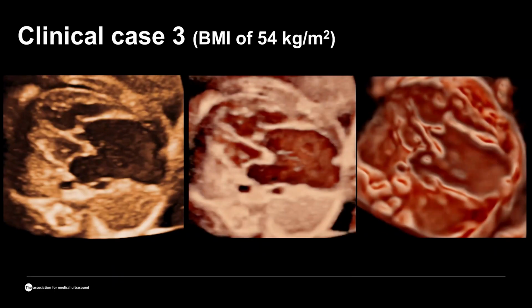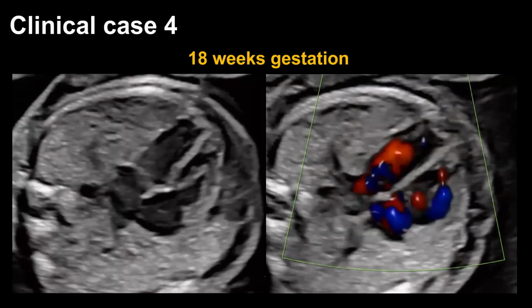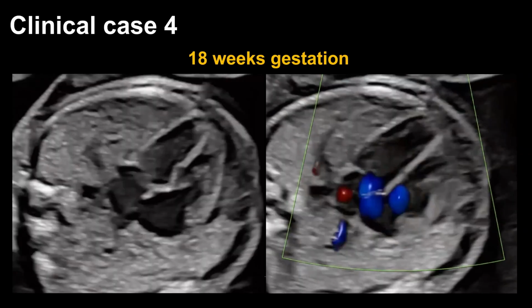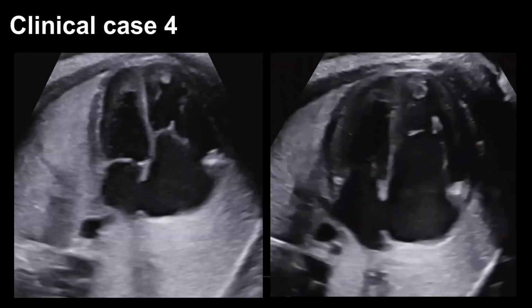And of course, we can reconstruct this heart that has obviously the severe malformation of the tricuspid valve, severe tricuspid dysplasia that can be presented in the different types of the 3D surface rendering imaging. So, but some of these malformations are not that easy to diagnose. And this is the heart that was called pretty normal at 18 weeks gestation, with the exception of the small regurgitation on the tricuspid valve.